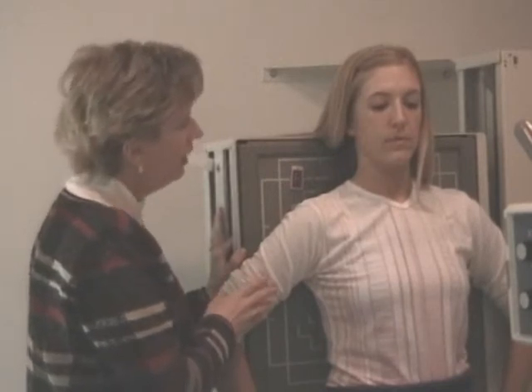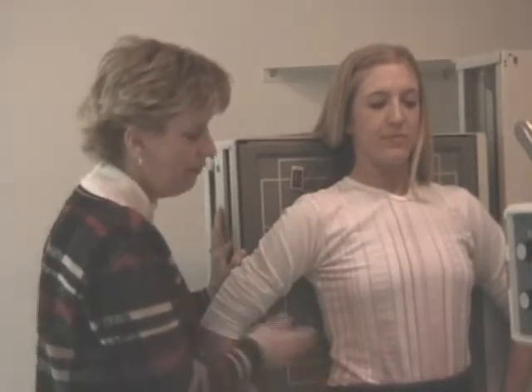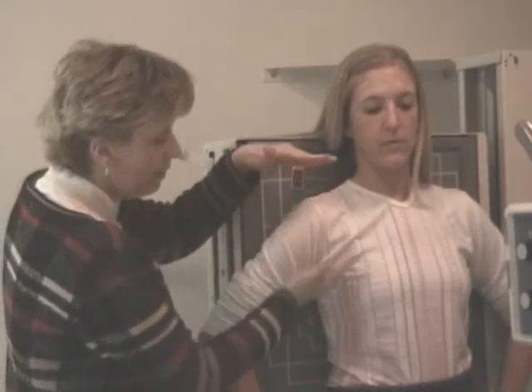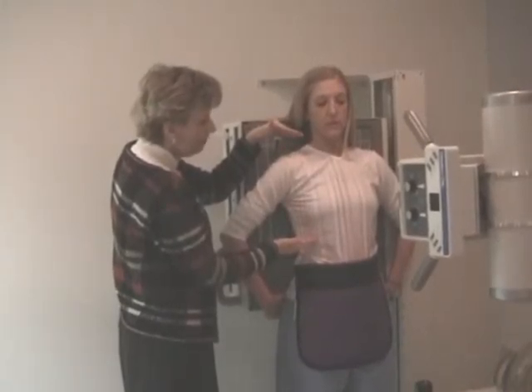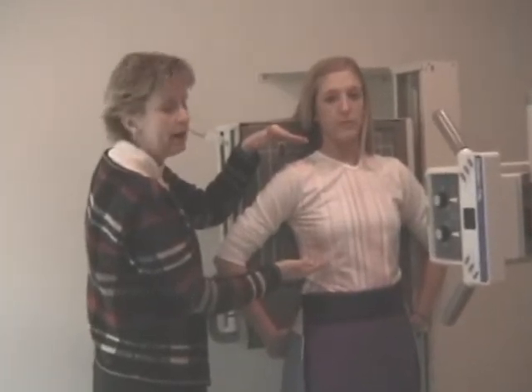I'd have the patient take in a deep breath, as deep as they can, and hold it in. That will drop the diaphragm down. The patient may be able to take only a little breath in, and if they're hurting, the diaphragm will drop some, but not as much. We're having the diaphragm drop so we can get as many ribs into the image as possible above the diaphragm, because you have a density issue with tissue thickness in the body.